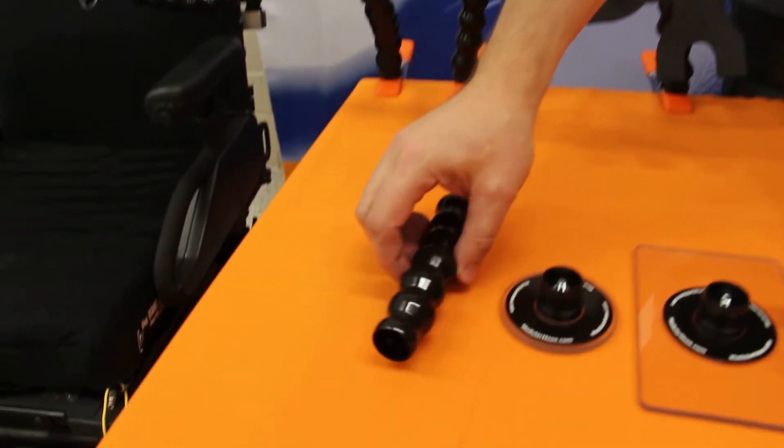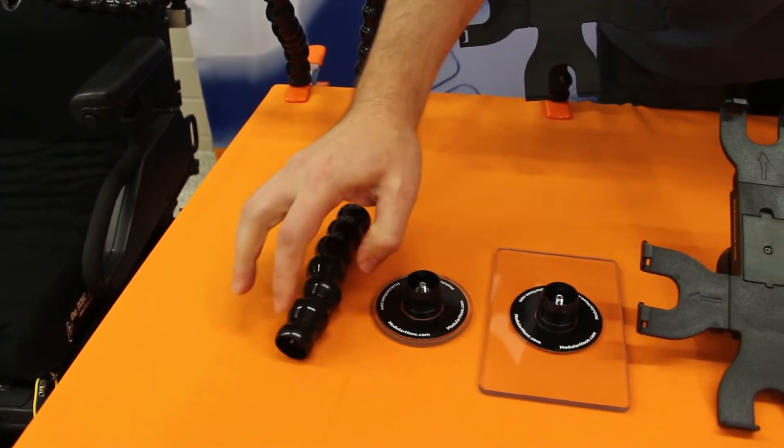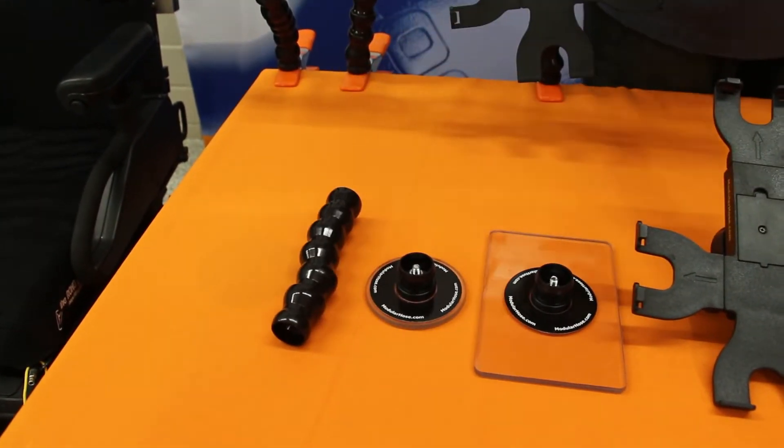The first component here is the lock line tubing itself. It's flexible, it's positionable, and each bead is independent from the next. There are three different sizes.